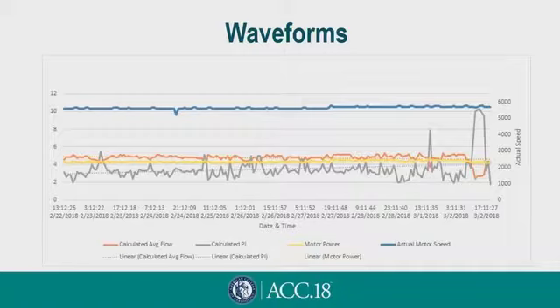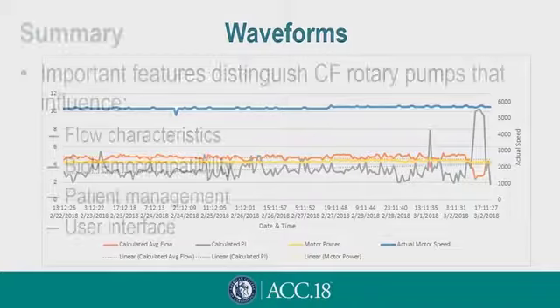Here's an example of a waveform from the HeartMate 3 pump. Again, if you look at the far right of the panel, you can see an abrupt drop in flow consistent with cardiac tamponade. Those are signals that can be very informative in patient management.